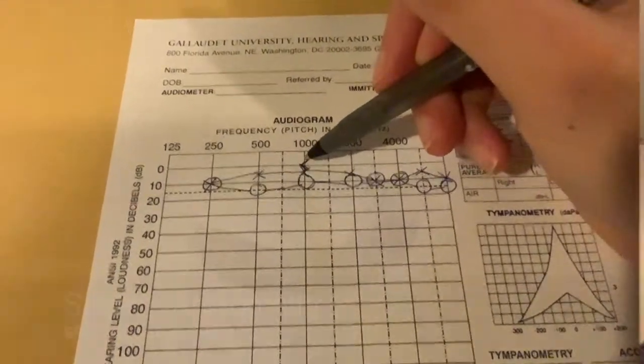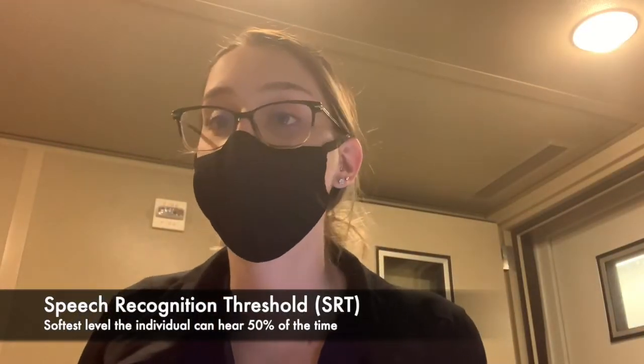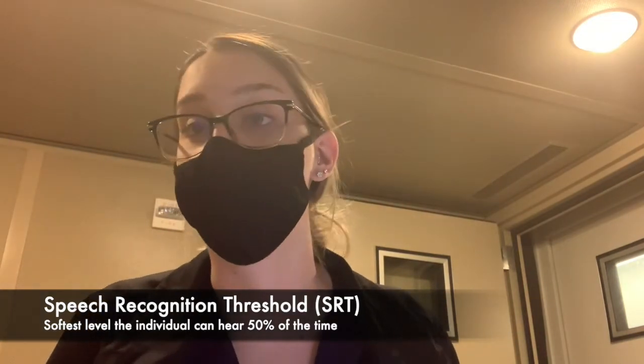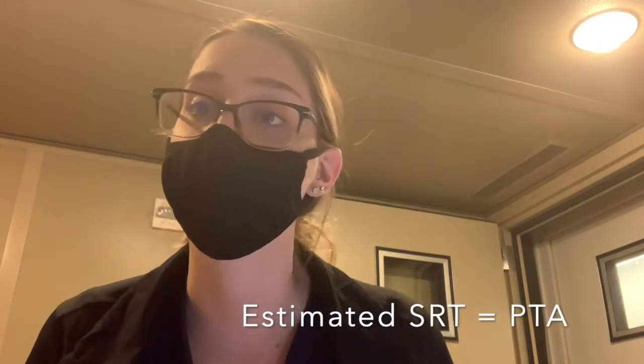All right, so now that we've gone through the pure tone audiometry, we're going to talk about the speech audiometry. There are a couple of different components to this, including SRT, or speech recognition threshold, SDT, which is speech detection threshold, and WRS, which is word recognition score. For the SRT, your starting level is going to be 30 dB SL above your estimated SRT. Your estimated SRT is equivalent to the pure tone average that was collected using the pure tone audiometry.